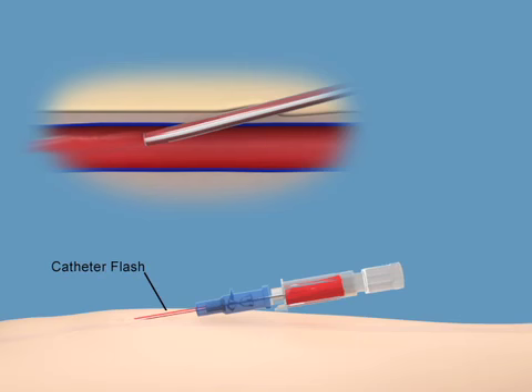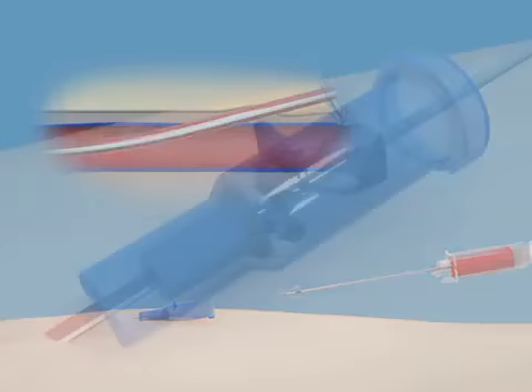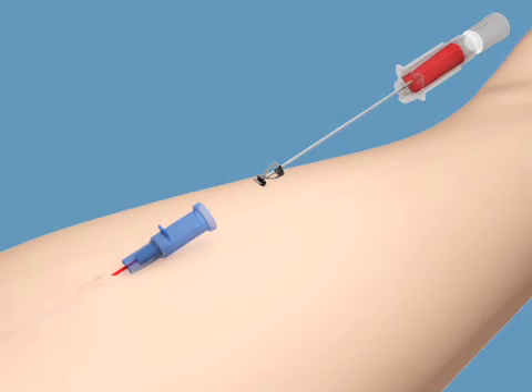A second flashback — catheter flash — occurs between the catheter and the needle, confirming that the catheter is successfully in the vein. Once the catheter is advanced completely, the needle is withdrawn in a swift continuous motion. The safety shield on the B-Bron Intracan Safety IV Catheter engages as the needle tip passes through the catheter hub. It deploys automatically and permanently shields the needle tip, protecting against needle stick injuries.